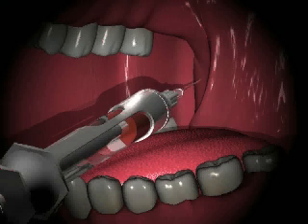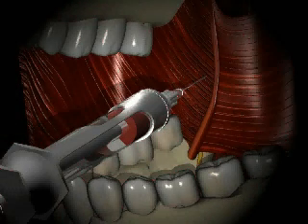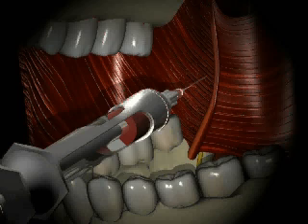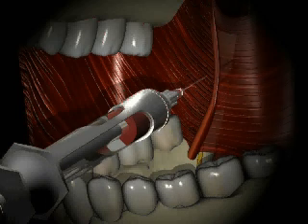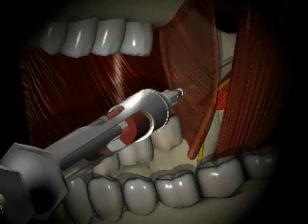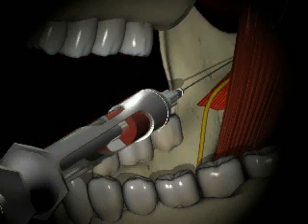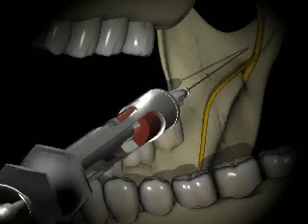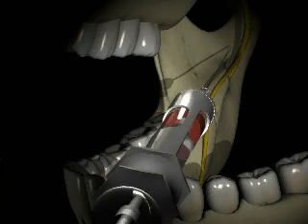The needle is now passing through mucosa, a thin portion of buccinator muscle, loose connective tissue, and adipose tissue. It lies lateral to the medial pterygoid muscle and the sphenomandibular ligament, and medial to the ramus of the mandible.